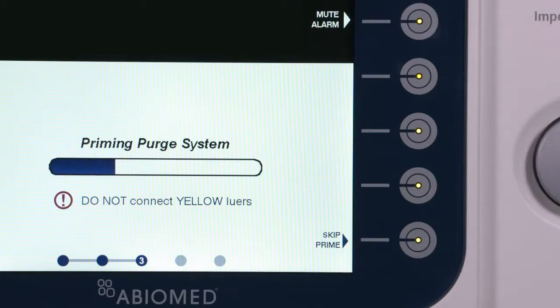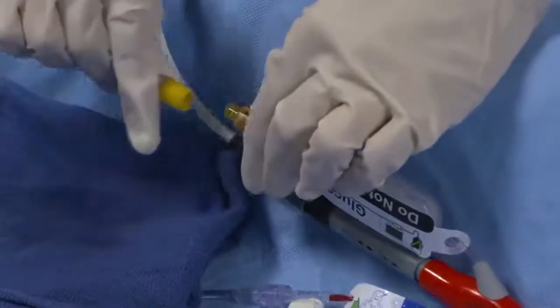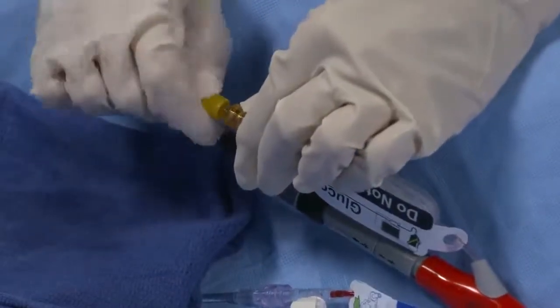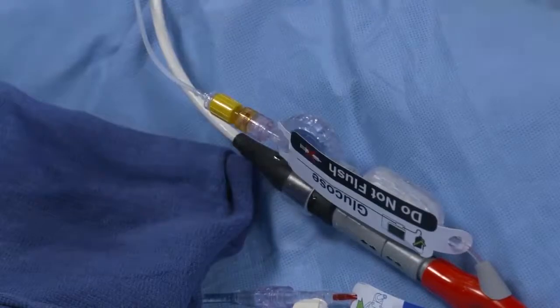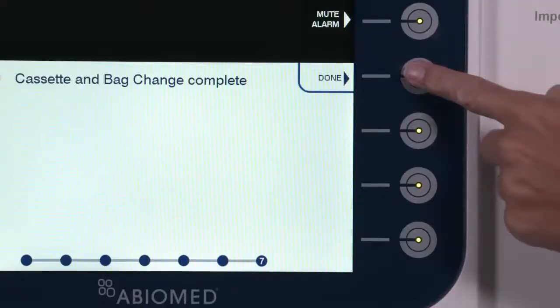Once priming is complete, the AIC will automatically advance to the next screen. Connect the yellow lure on the Purge tubing to the yellow lure on the Impella catheter using a wet-to-wet connection. The Change Purge Fluid procedure is now complete. Press Done to exit the Purge Wizard.